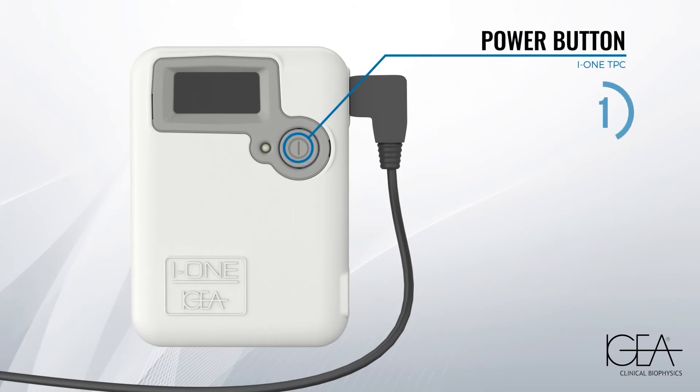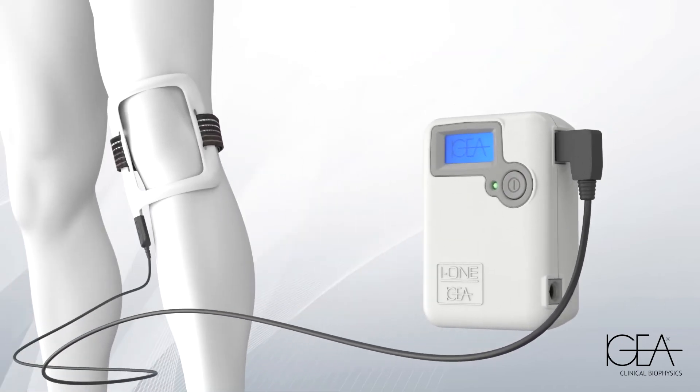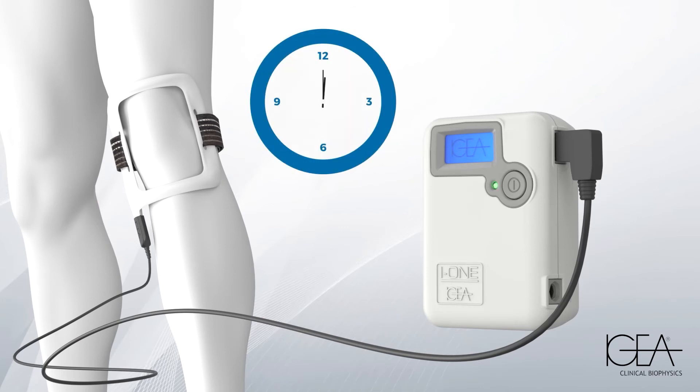Press and hold the power button to start the therapy. The treatment parameters are preset according to your condition. The device uses undetectable frequencies, so don't worry if you don't feel any sensation.